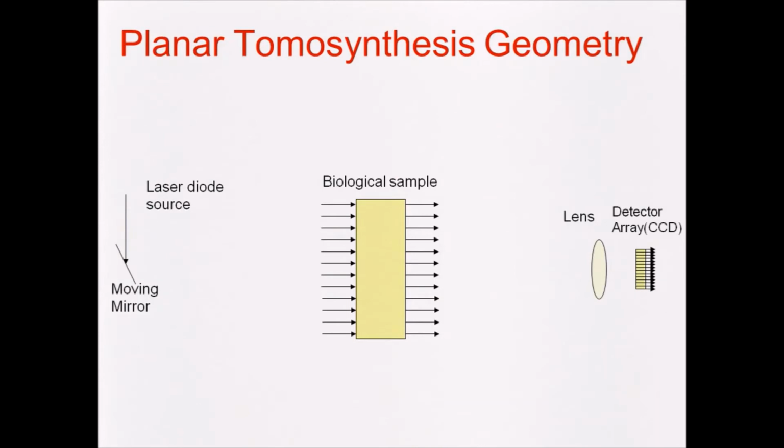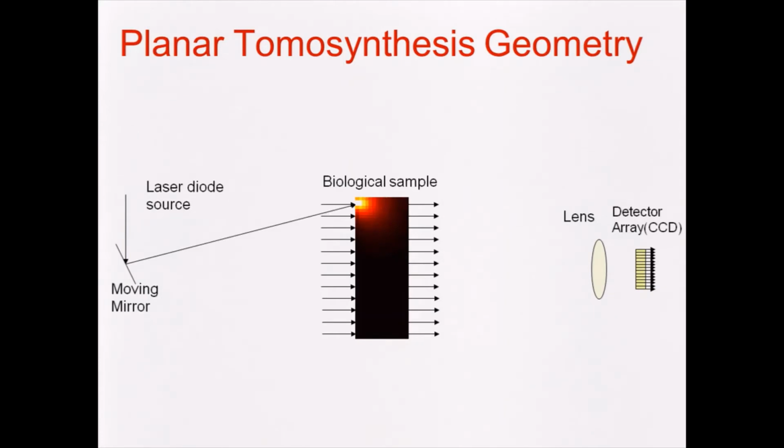Finally, with the tomography, what we're doing is shining light in from one direction, and so it illuminates the pattern like this. And then on the other side of the tissue, we have a detector that's sampling the tissue with a sampling function, something like this. For any particular measurement, we have a source detector pair which samples the tissue like this. And then we have a bunch of these different measurements that sample like that.